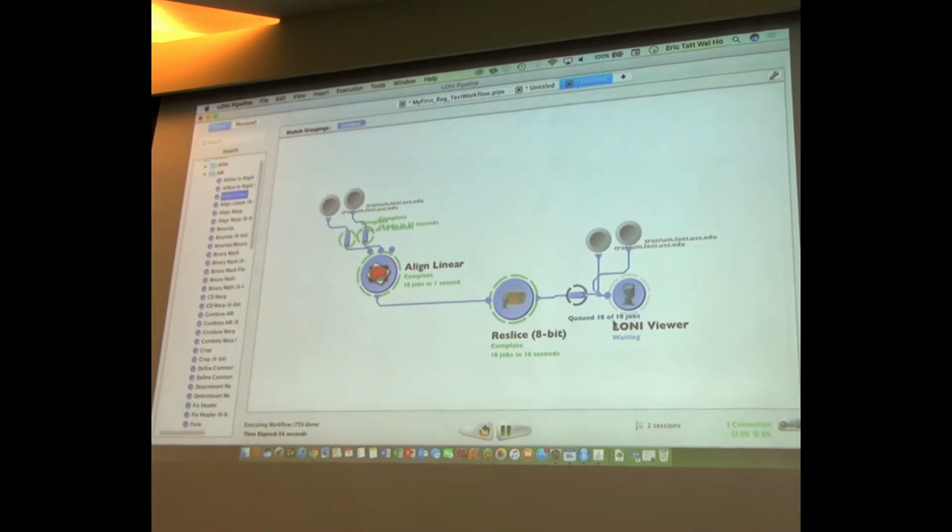But I wanted to show you a little bit about how the viewer shows you the target of the registration, the original data, and the resliced data. And because we have 10 input data sets, this is going to be repeated 10 times. So I'm going to put a stop to this quickly. But let's just see, okay, this last conversion, 90% done. Okay, so look what happens now. I should be seeing these pop-out dialogues that illustrate the viewer.